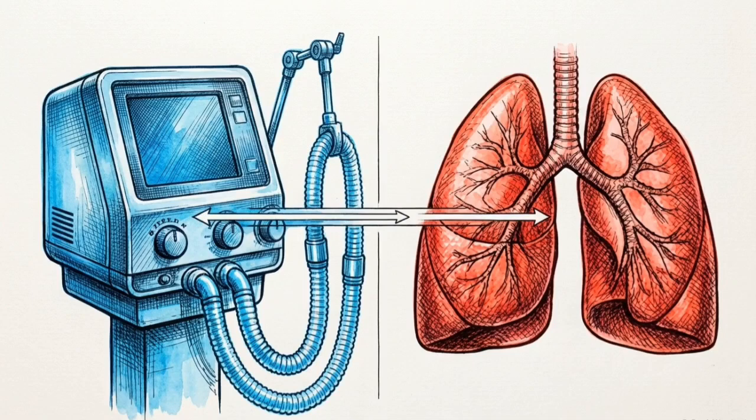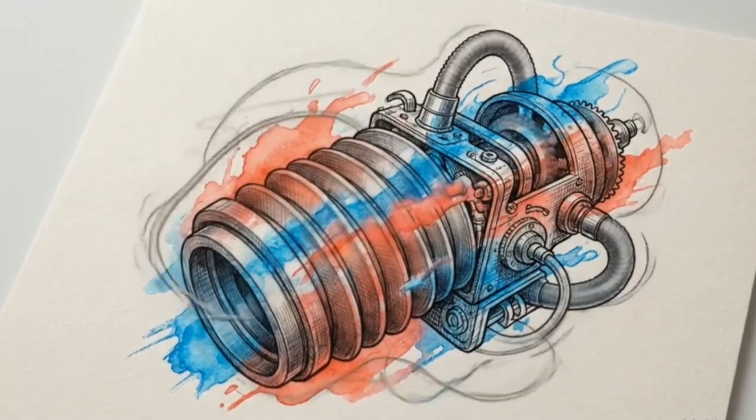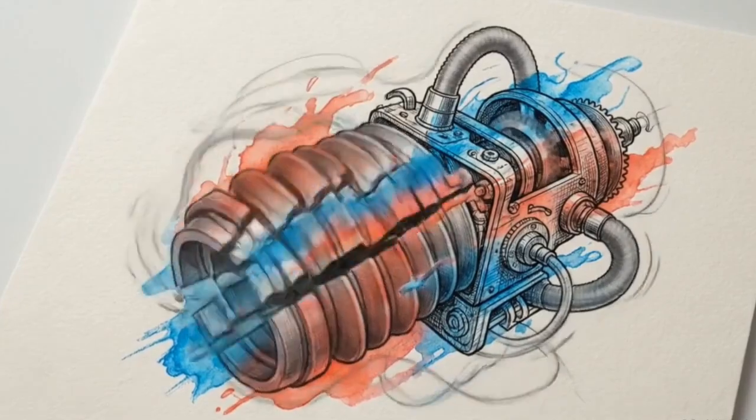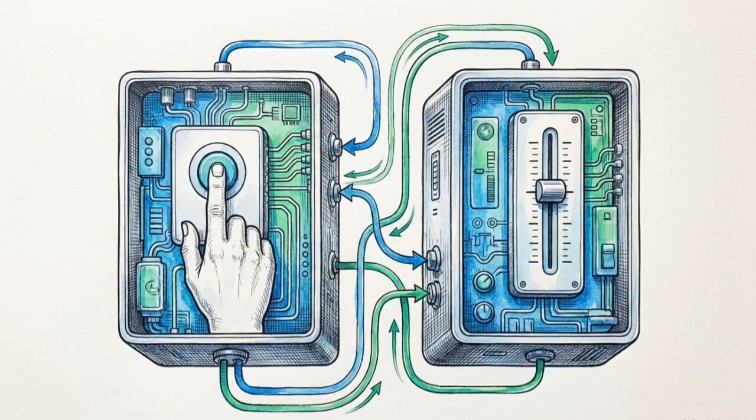Mechanical ventilation is a dynamic partnership between a machine pushing air and a patient's own respiratory drive. If the machine's parameters fail to match the physical needs or efforts of the patient, the entire system collapses. To prevent that mismatch, we rely on a single two-part algorithmic question: who starts and what is controlled?